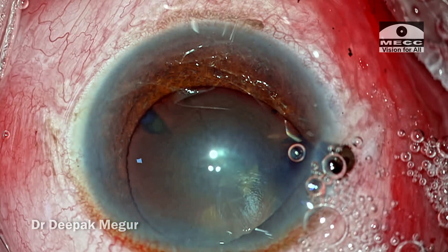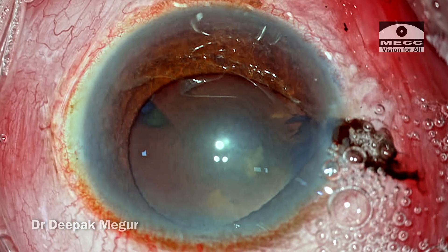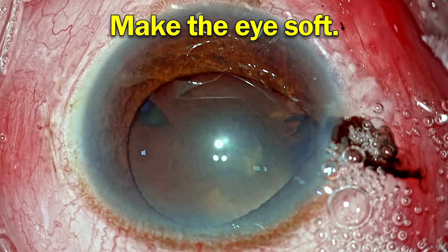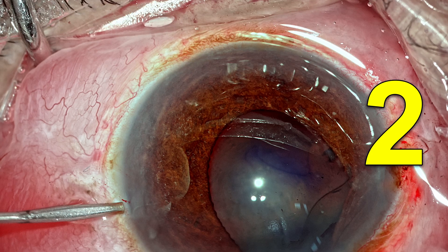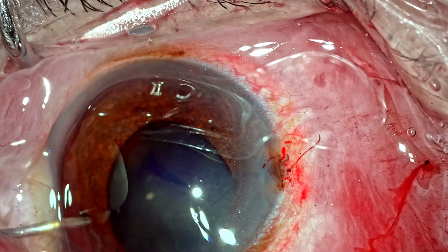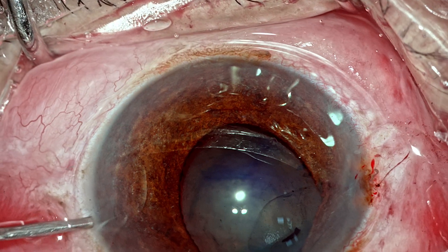Whenever we are dealing with such a situation, the first thing we need to do is reduce all the risks which can raise the pressure inside the eye. The first thing to do is loosen the speculum — your speculum could be pressing the eye. Loosen the speculum. Number two, decompress the chamber so that the eye becomes soft. I'm going to use the second side port to decompress the chamber.